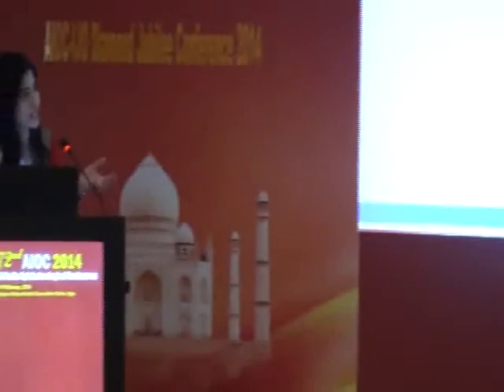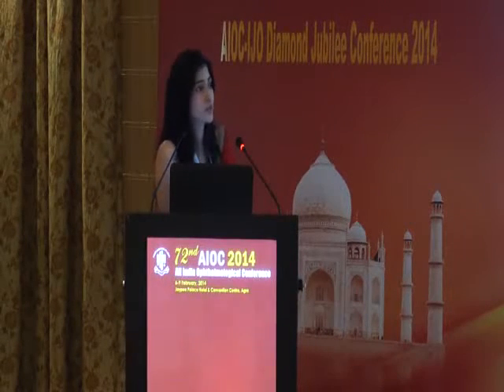Because of the difference between monofocal and multifocal in contrast sensitivity, the same will carry over with the Sulcoflex also, because then now you have, as you discussed, the optical quality. Yes, but previous studies, however, have not analyzed the optical quality per se, but studies have analyzed results of bilateral Sulcoflex IOLs, and they have found that as far as the vision and contrast is concerned, Sulcoflex does pretty well, but we of course have not done it, so I cannot comment from our experience.